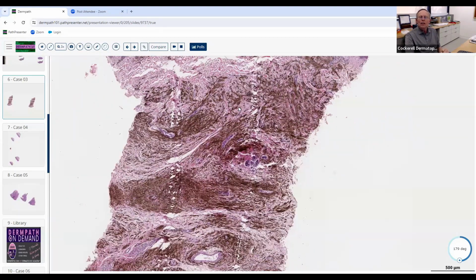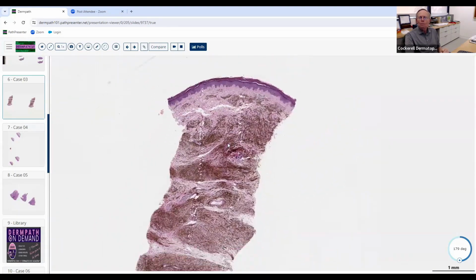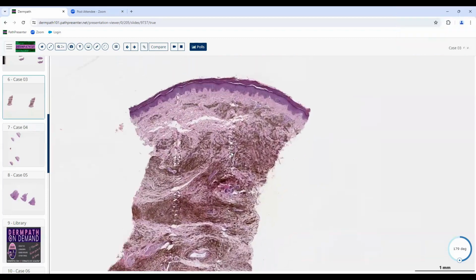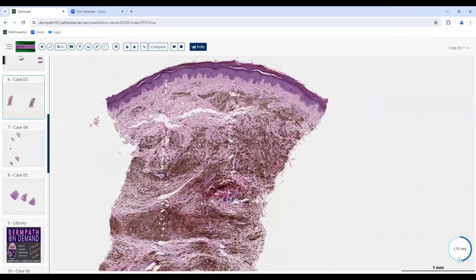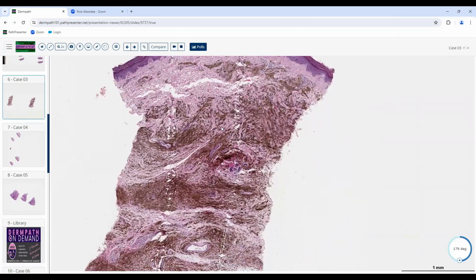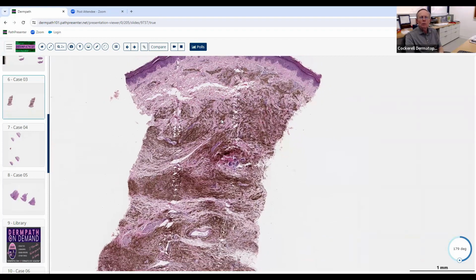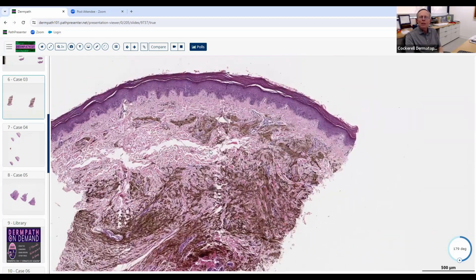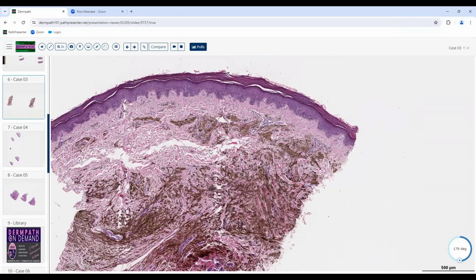Now, what is another pattern of blue nevus that we commonly see, even more common than this? I know there's the deep penetrating. I don't know if it's more common or not. Yeah, those are rare, actually. Those are much less common. But the most common type of blue nevus when you biopsy it, what does it look like? It's just normally more in the superficial dermis, smaller.